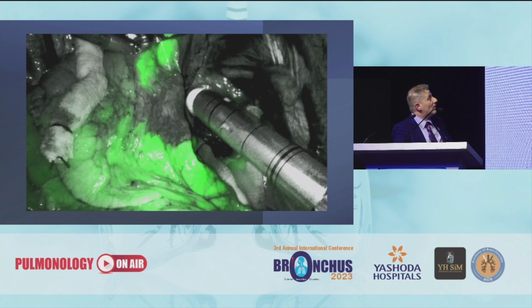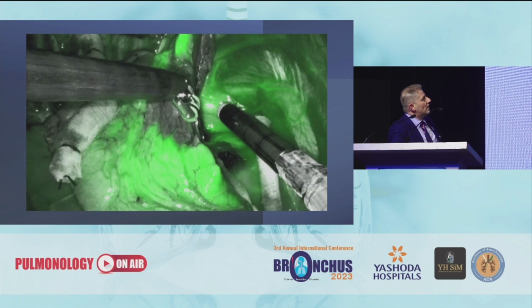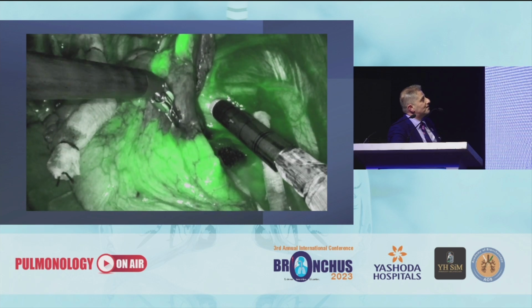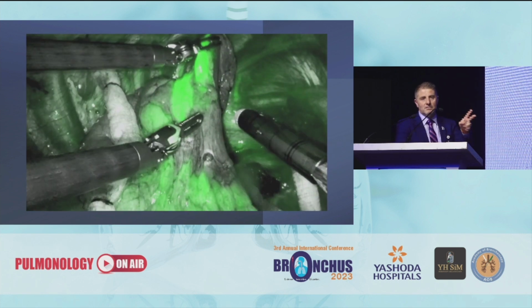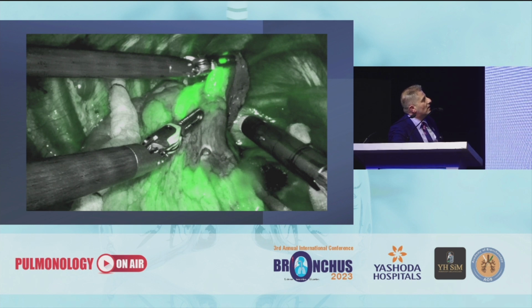Now you can see the signal from the ICG labeling is different from the one coming through the venous. This helped the surgeon a lot to make some cautery marks on the lung to know where to put the blade to start the resection. And you can see by turning the lung anteriorly and posteriorly, you still have a clear signal from the fiducial marking.